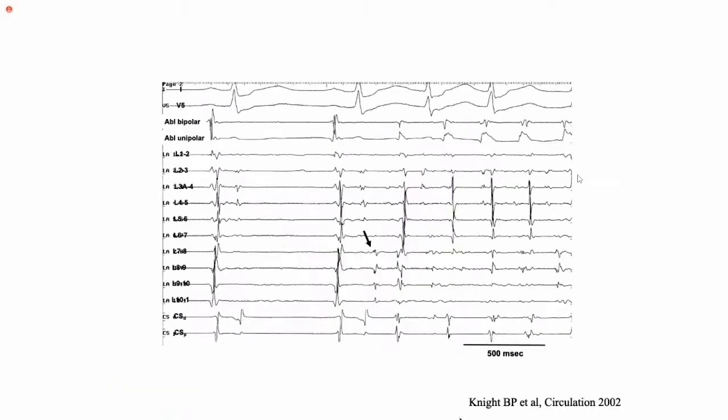You know, in the early studies, this was 20 years ago, the Bordeaux group showed in 1998 that the pulmonary veins were a trigger for a lot of patients with AFib, in particular patients who had no significant structural heart disease. And this is what we would see. There was no lasso when they were doing this. They developed this circular mapping catheter to put in the pulmonary veins.